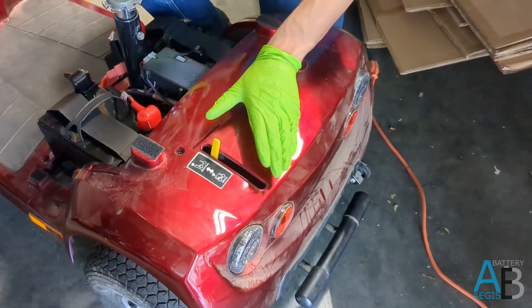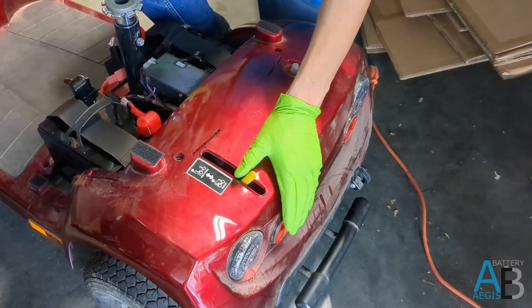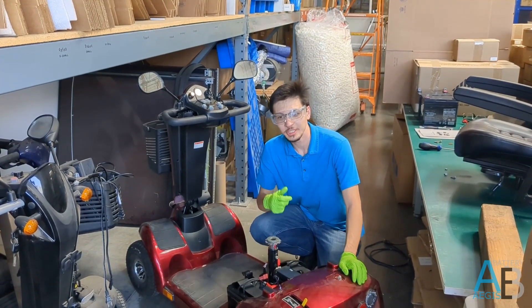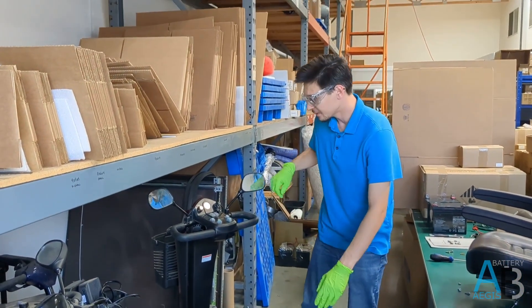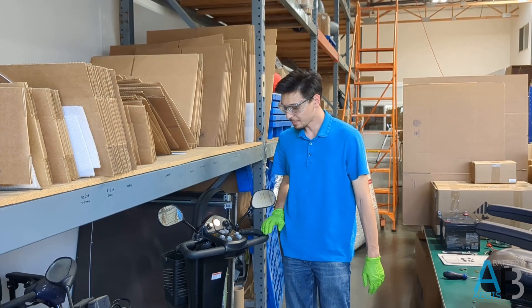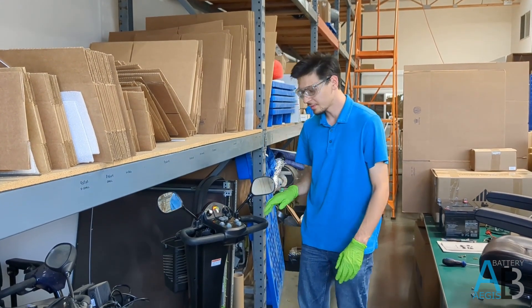Before turning on your mobility scooter, make sure this lever is set to drive. Now that we've successfully connected the batteries, we should check that everything is in working order. We do this by turning the mobility scooter on, checking the battery meter, and giving it a small amount of power.